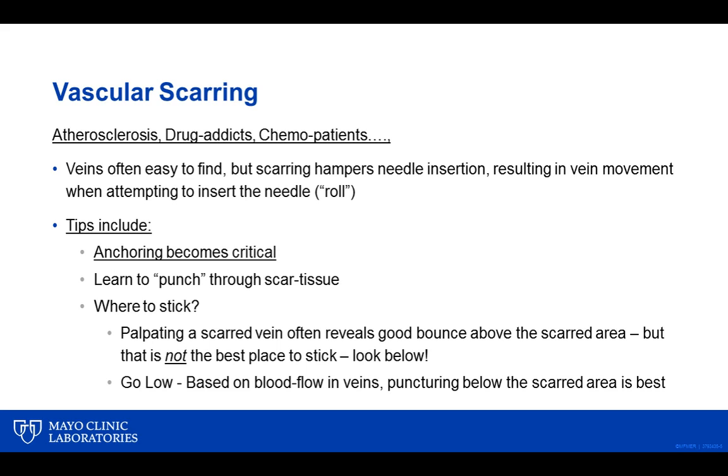Where to stick when we access or palpate a vein that we can feel is quite hard from scar tissue. Oftentimes, while we're palpating, we go above the scarred area and we feel great bounce. And so the inclination is to stick there, and in reality, that is not the best place to stick. Recognizing the blood flow as it flows through the arm is up towards the heart. So trying to get the blood from a scarred vessel above the scarred area actually is difficult to do.